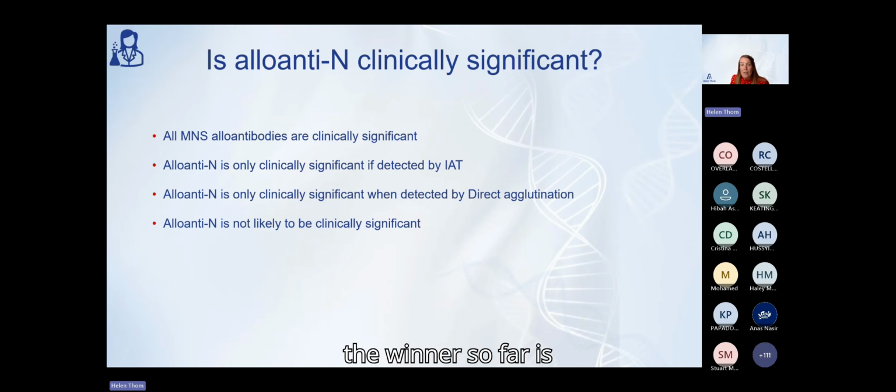So the winner so far is allo-anti-N is not likely to be clinically significant, and that is actually the correct response to that. But these talks are all about education and learning, so if you didn't know the answer to that, that is absolutely fine. That is what your guidelines are for.